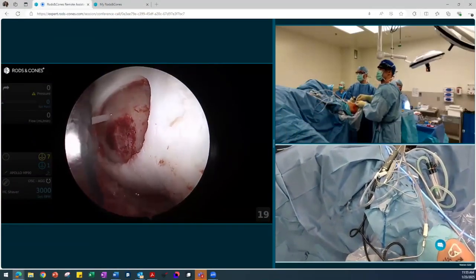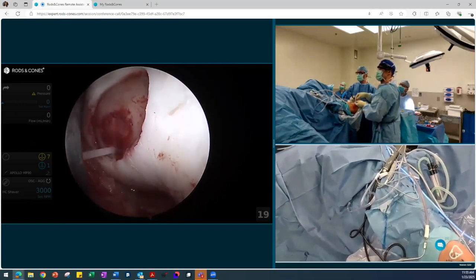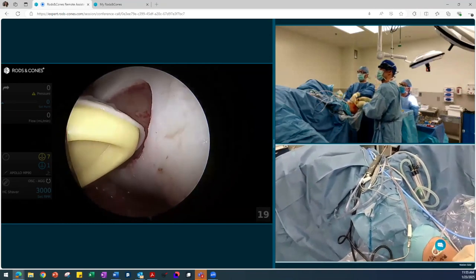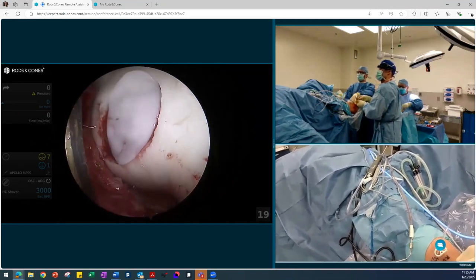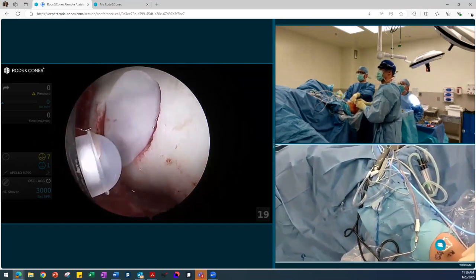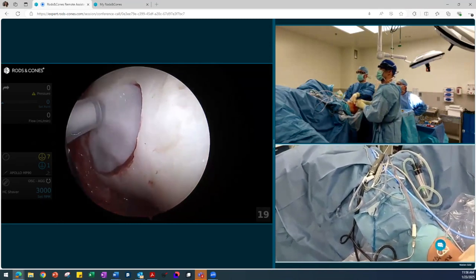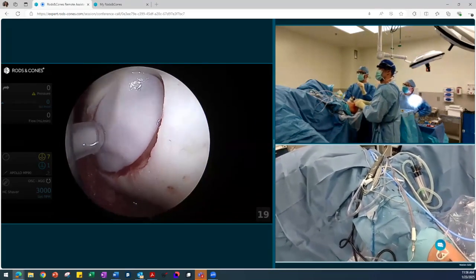Now what we're going to do is place a little bit of Tisseel on the defect, and then we're going to use the V shuttle to put the cell side down, and you'll have the shiny side up. Again, key here is to deploy it as close to the orientation as you want, or possibly can, and then you're going to use the small plastic tip to gently maneuver the membrane into the defect appropriately.